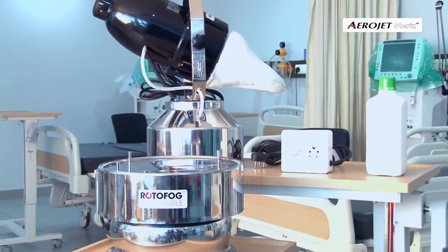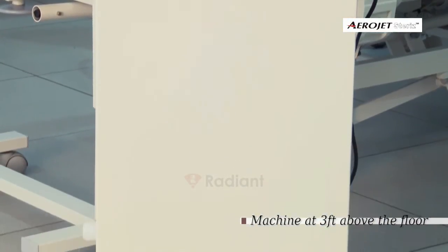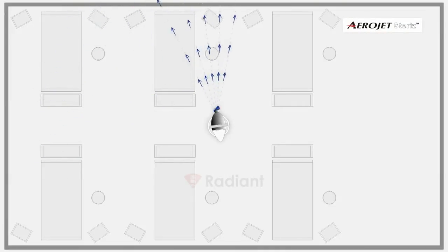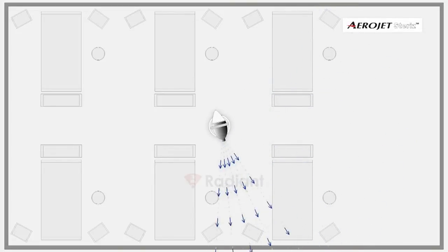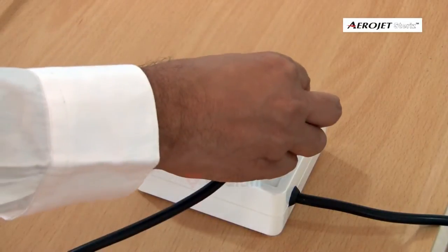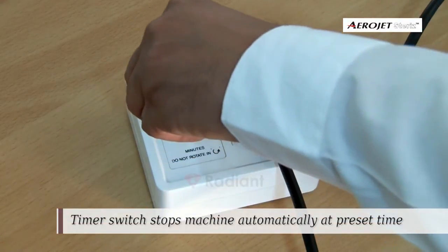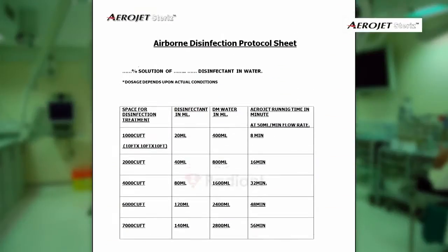If you are planning to use Rotor Fog with Aerojet, place the Rotor Fog on a steady table at three feet height, preferably in the center of the room. Place the Aerojet on it and make the necessary power connections. Set the timer knob in a clockwise direction to the time value determined from the protocol sheet.